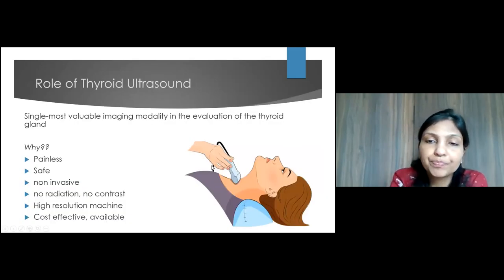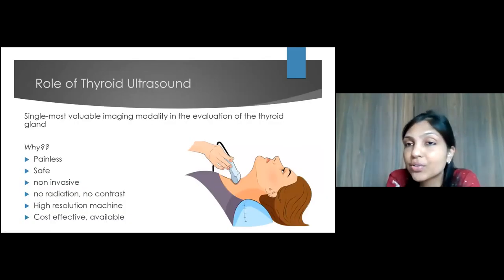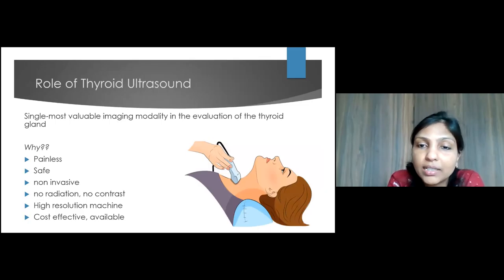Over the past decade or so, the role of thyroid ultrasound has been defined even more. It has become the single most valuable imaging modality in the evaluation of thyroid disease. It has found its unique niche. And when you ask why, it is the availability, the portability, it's very safe, non-invasive, and there is no radiation associated with it.